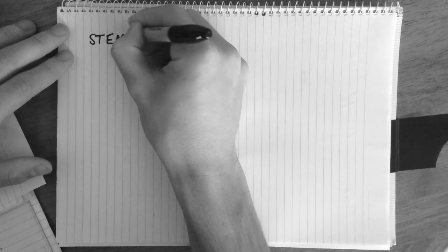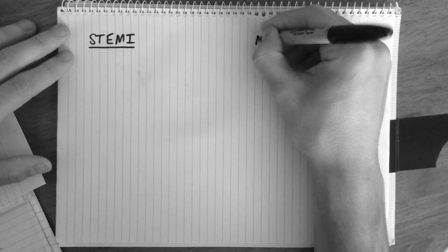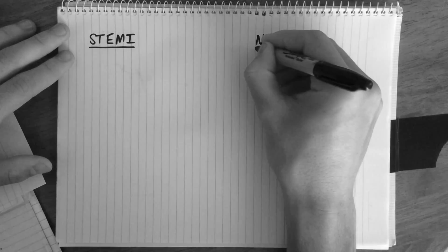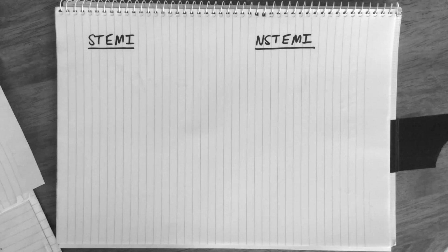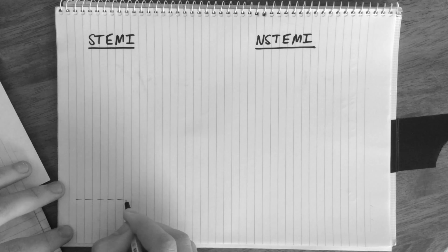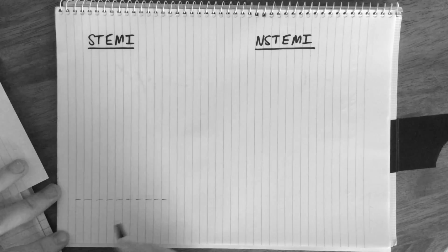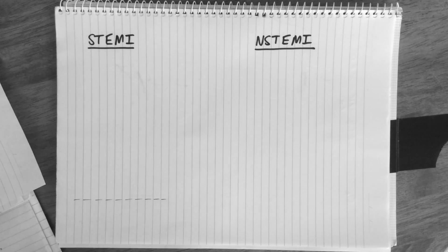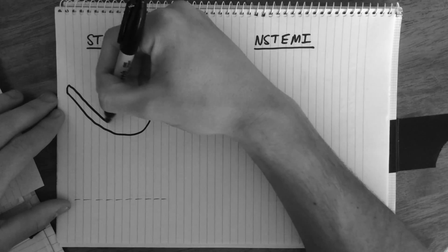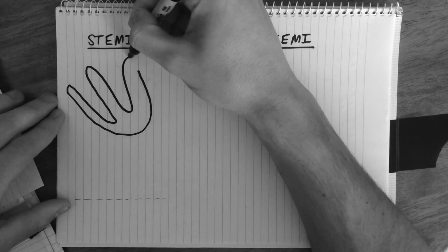In this video, I'd like to explain the ST segment changes we see on our ECGs in ST elevation myocardial infarctions and non-ST elevation myocardial infarctions. So firstly, the key to understanding this is to realize that it is the baseline of our ECG which shifts following infarction, not the ST segment itself.